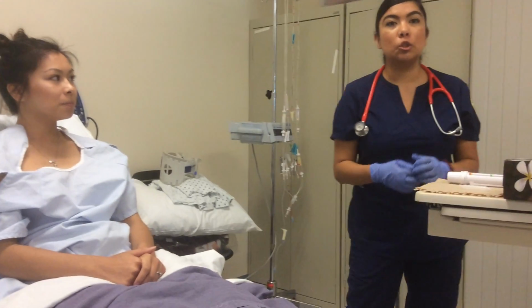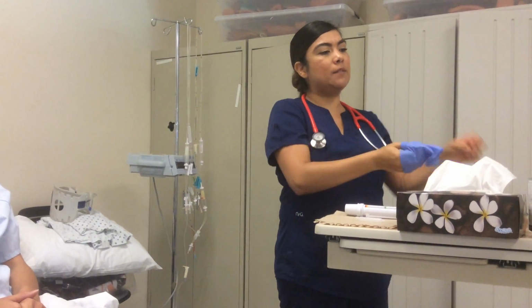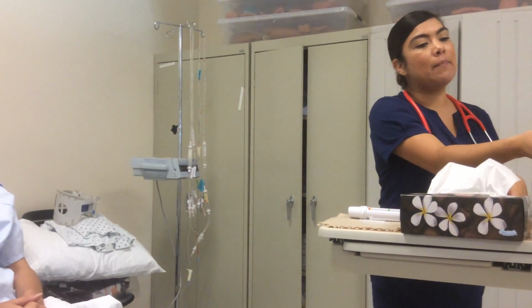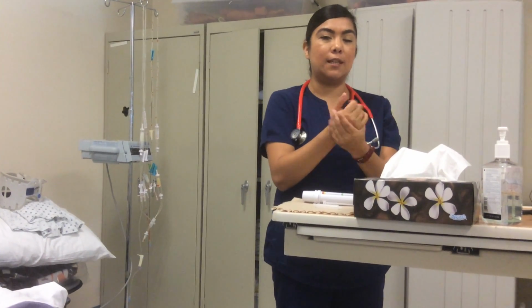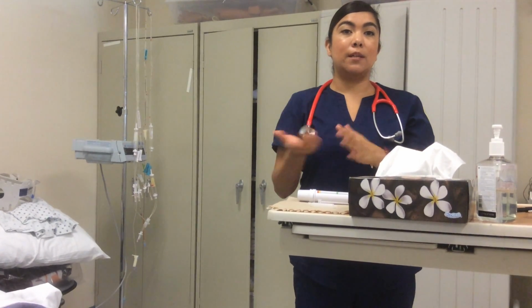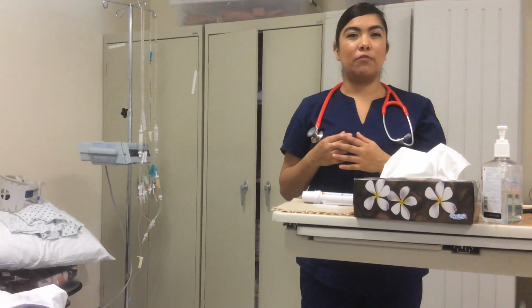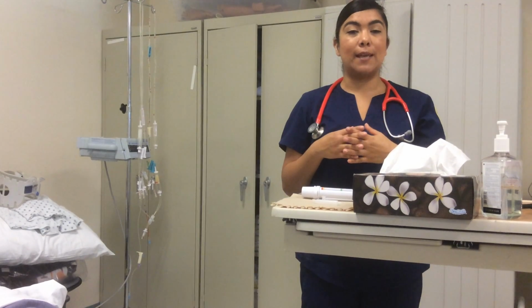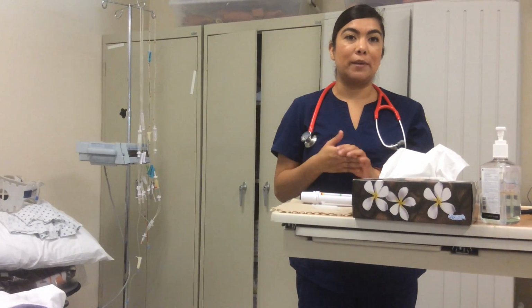Perfect. I'm just going to go ahead and walk out to the patient's chart. Going to go ahead and remove my gloves and toss them. And then I'm going to get 3 mLs of hand sanitizer, and again, 15 to 20 seconds or until it's completely dry. And so what I'm going to do now is document the peak flow results, all the vitals that I took, how the medication made her a little bit jittery after it was administered, and that once I left her room, she felt better, so her jitters were already gone. So I'm going to document all that.